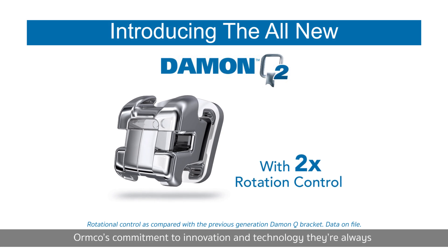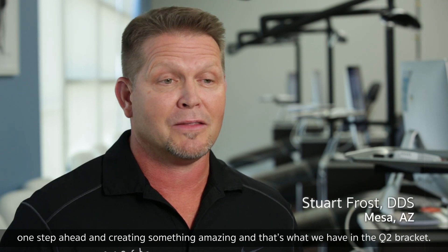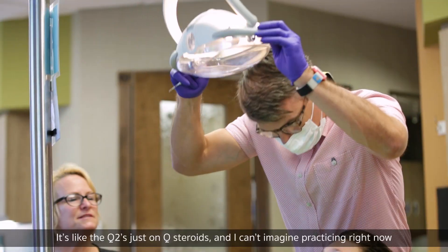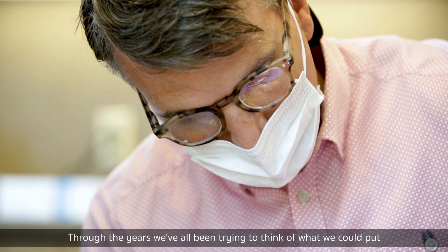Ormco's commitment to innovation and technology — they're always one step ahead in creating something amazing, and that's what we have in the Q2 bracket. It's like the Q2 is just on Q steroids, and I can't imagine practicing right now without the new Q2 bracket in my hands.